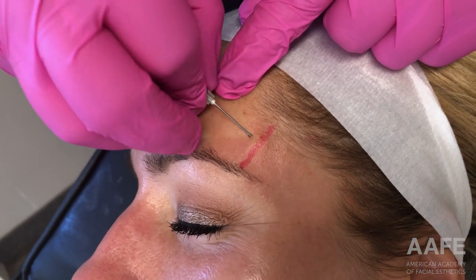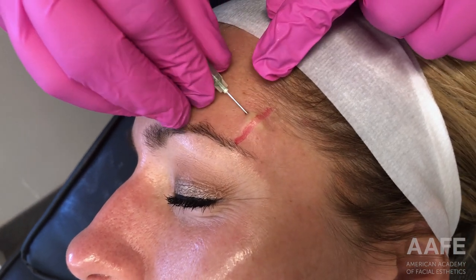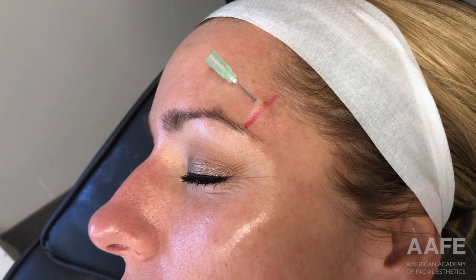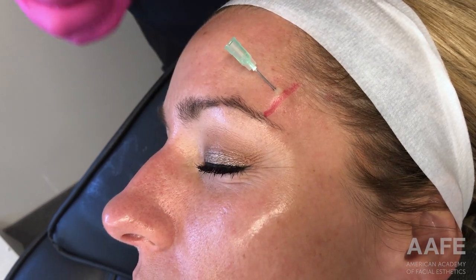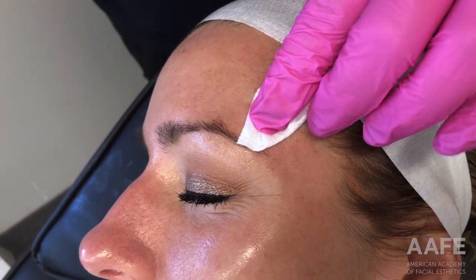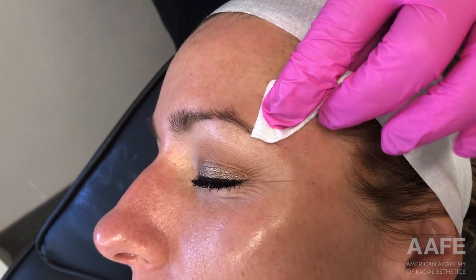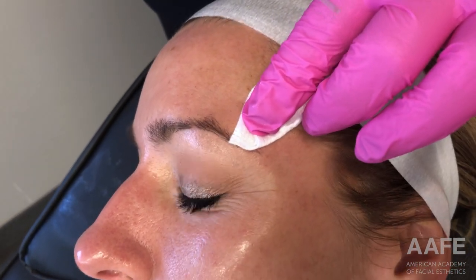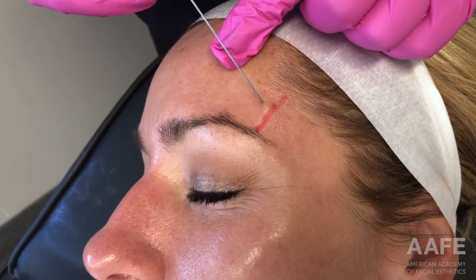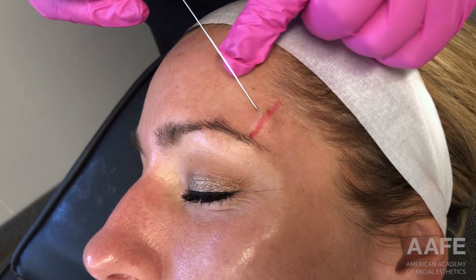I have found my temporal fusion line on this patient. As you could tell, I was looking for my anatomical landmarks, marking out the temporal artery, and making sure that where I plan to treat is going to be safe. The temporal fusion line is often easier to palpate when you have the patient clench — you can feel that fusion line. I am going to enter just above it, no more than a centimeter above that temporal fusion line, with a 22-gauge cannula.